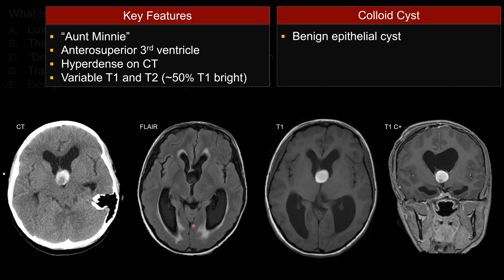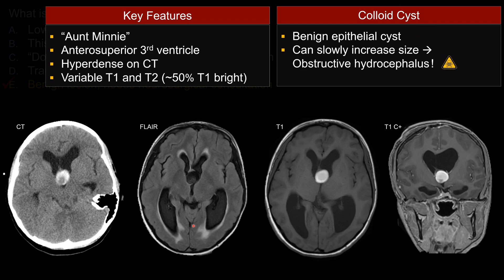It's a benign epithelial cyst. However, unlike other benign cysts such as arachnoid cysts, this lesion can grow, and that can cause obstructive hydrocephalus. There are reported cases of patients dying from acute obstruction. Here you can actually see our patient has signs of acute obstruction with periventricular interstitial edema around the ventricle on FLAIR. That is an important point to remember — that's why this patient needs urgent neurosurgical consultation.